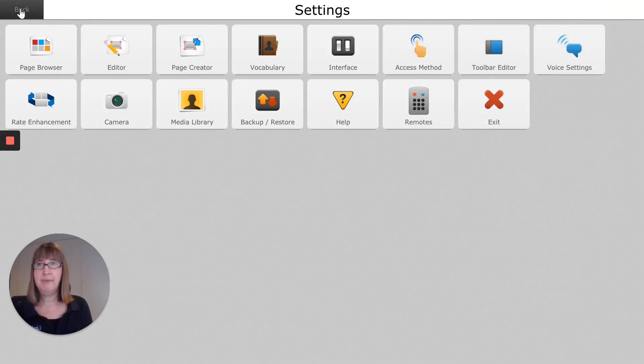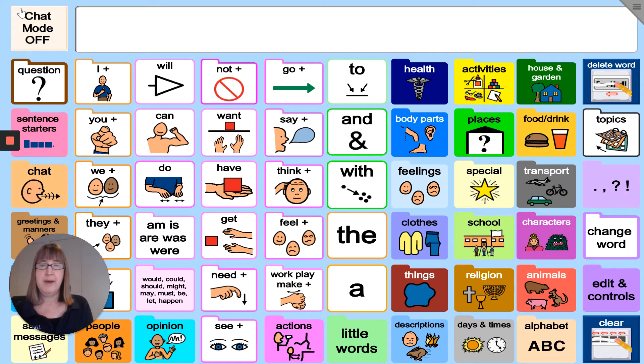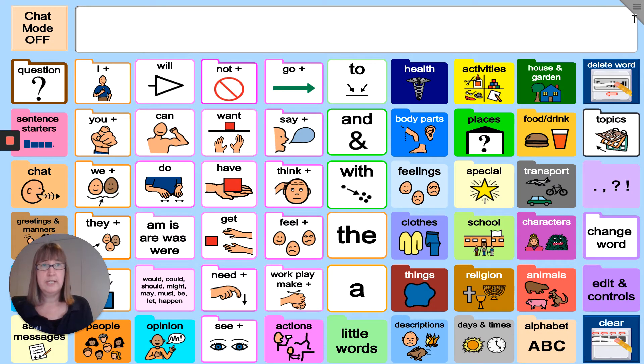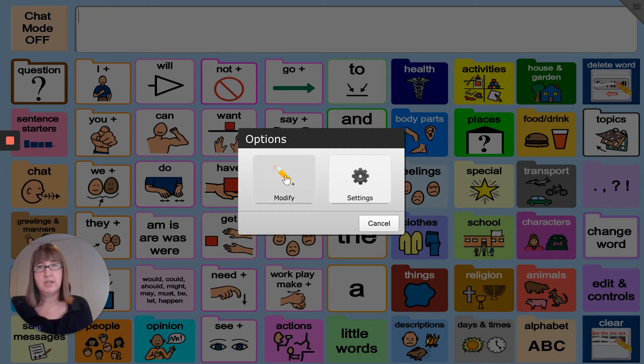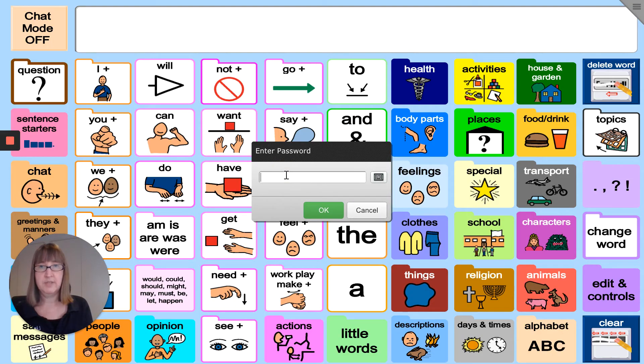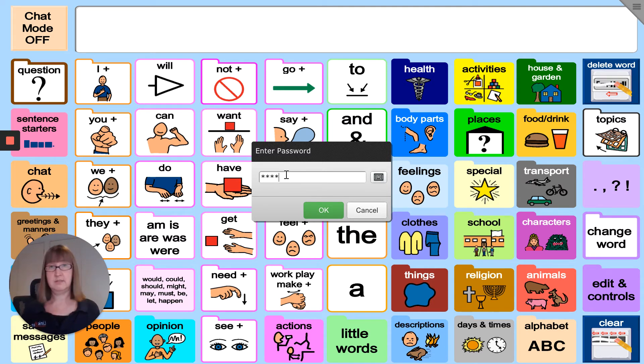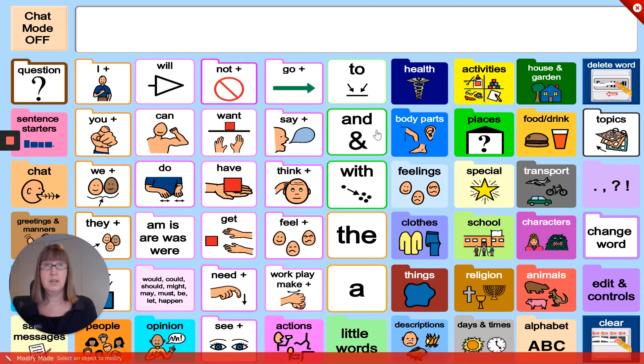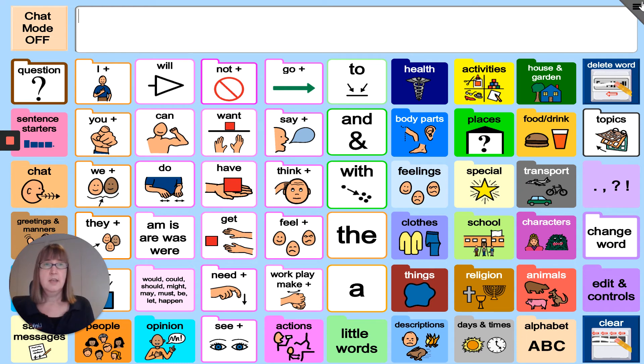Go back to our page, and now if I try to click on my menu button and try to modify something, it's going to ask me to enter a password. So I need to pop those numbers in and click OK to do anything in modifying or going into settings.